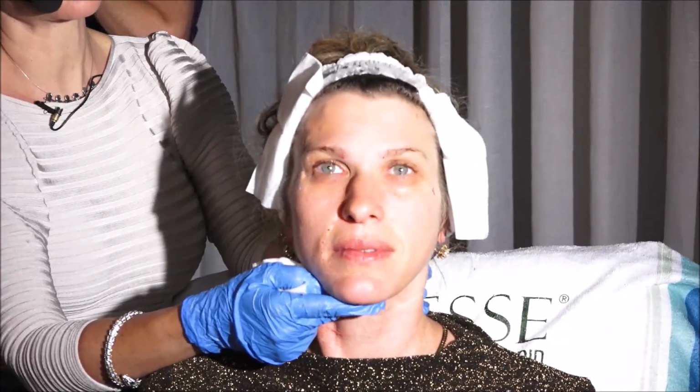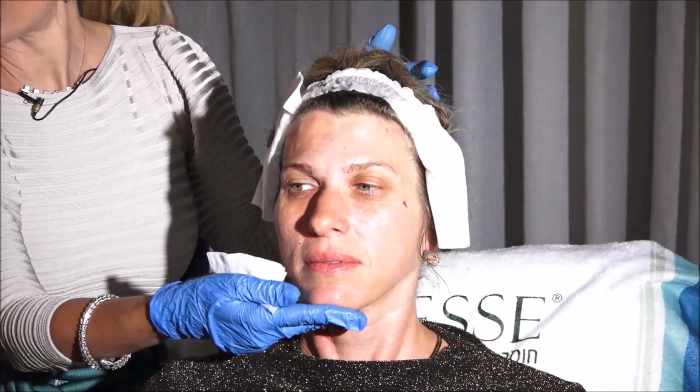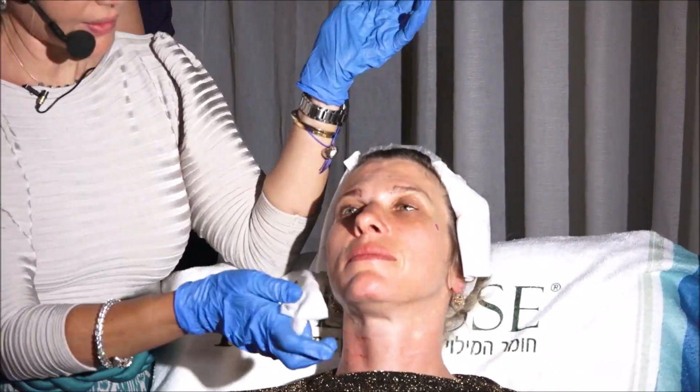So the face is very different from one side to the other. The neck, you can see a little bit of the laxity here, not anymore in this side. And this is immediately after, so we expect it to be better afterwards.